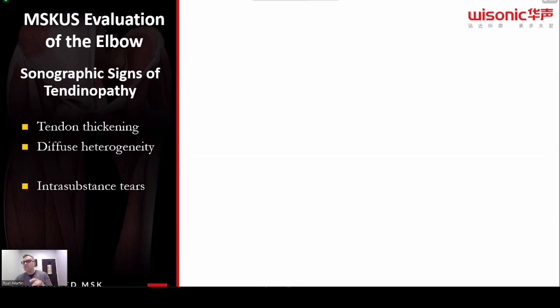Diffuse heterogeneity. So what does that mean? That means heterogeneous, right? So we talked about that. It just doesn't look consistent, right? And if I can paraphrase Dr. Joel Sellers, he would point at the wall and he would say, look at this wall. It has texture, but it's consistent texture. Now, if we go and scuff that wall up and put marks on it, well, now it is no longer consistent. It went from homogeneous to heterogeneous. So just think of that as your diffuse heterogeneity. And so the last one is hypoechogenicity, so those small little interdispersed spaces, and realistically, they look like small tears.